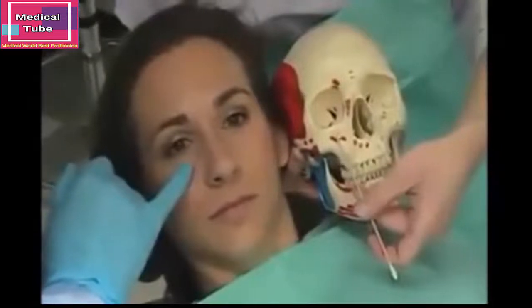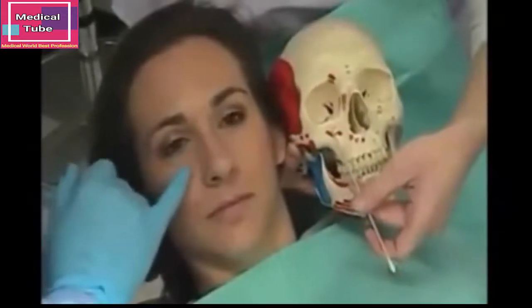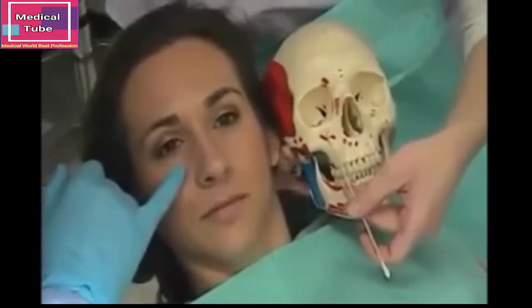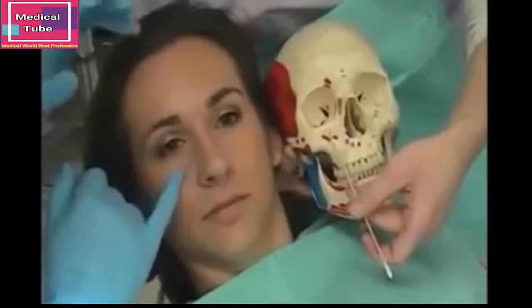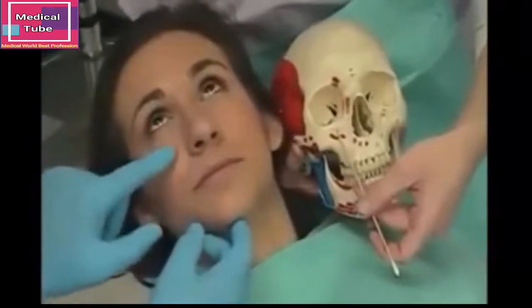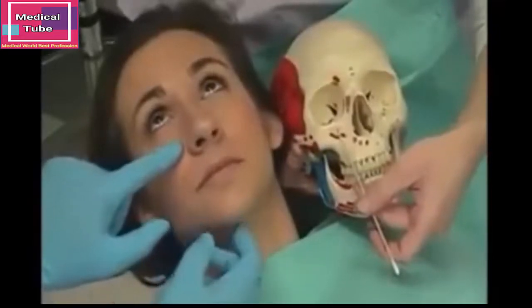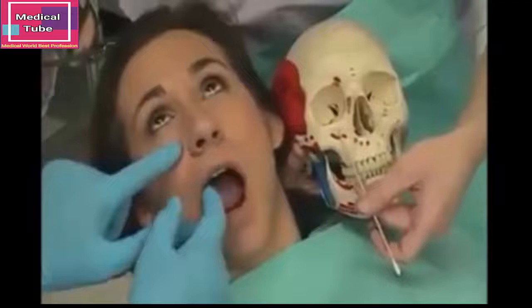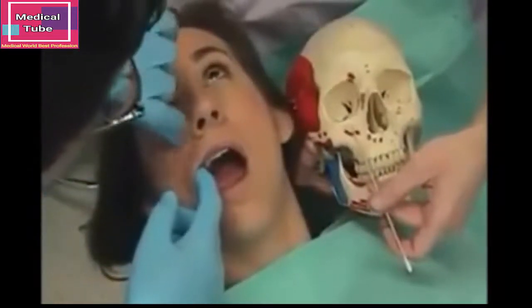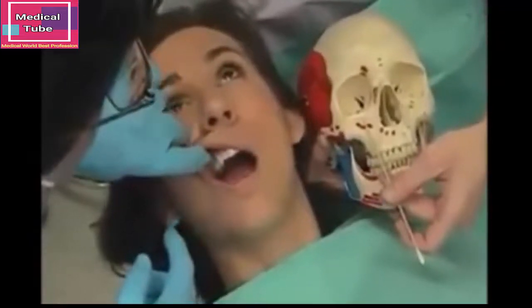Very, very important to use the normal anatomy to help you find that. Once you've found that, now we'll have Connie tilt her head back. Oftentimes very helpful to actually put your finger there once you've located that. Open. Tip your head back a little bit for me. Now, your index finger, retract the tissue, keeping your thumb there.